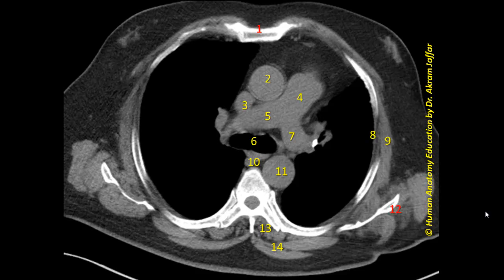Let's try to identify some of the structures and the level of the section. It's an axial CT of the thorax. The anterior aspect shows the sternum. Posteriorly, we can see the vertebral body, the rib attached to the body, the transverse process of a vertebra, and the mediastinum.